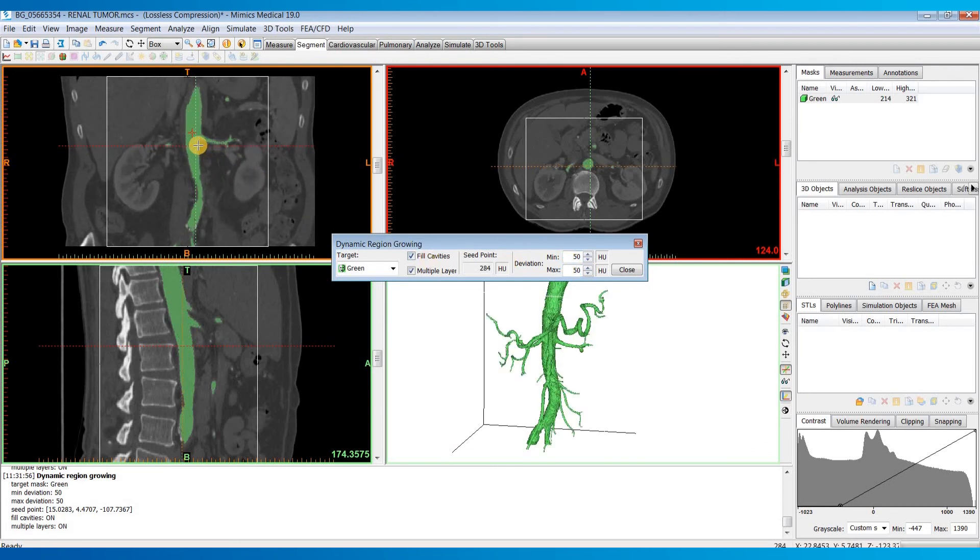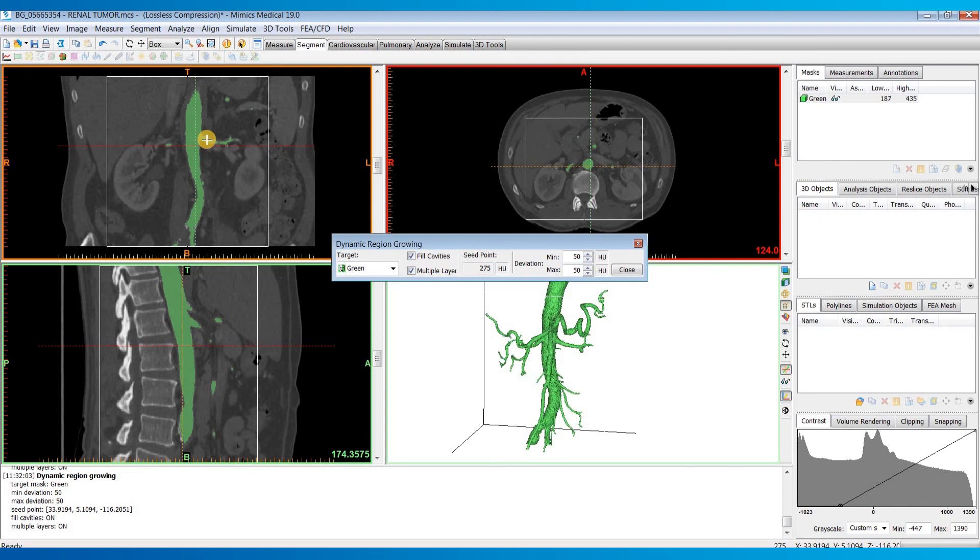And if you want, you can also hold down control and left click to place multiple seed points if maybe it didn't first capture a vessel with your first seed point that you wanted to capture.